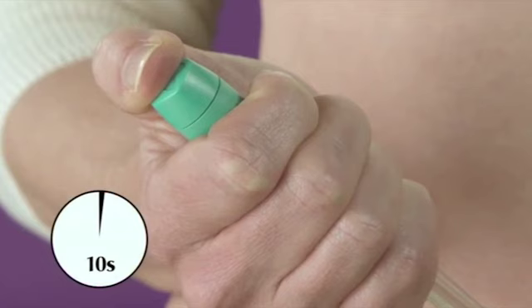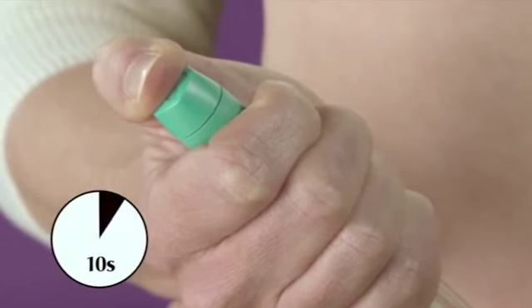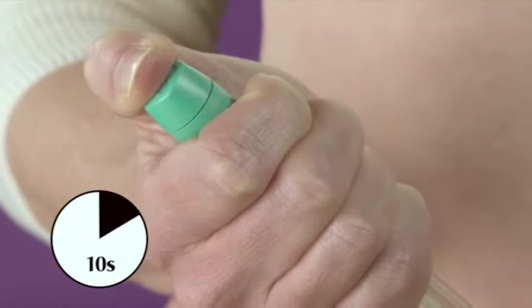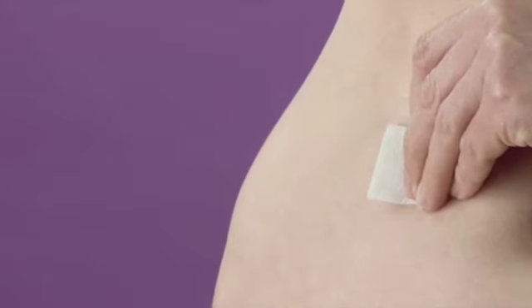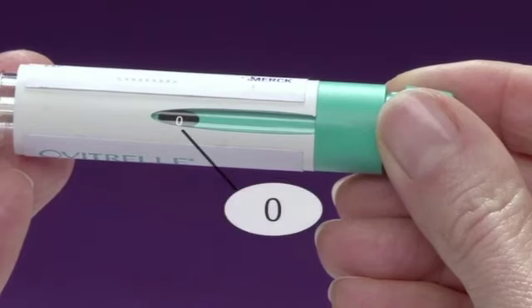With your finger still pressing the dose setting knob, keep the needle in the skin for 10 seconds. After 10 seconds, still keeping the dose setting knob pressed down, take the needle out of the skin. Apply pressure on the injection site. Make sure you have given yourself a complete injection. Check that the dose window shows 0. This will confirm that the dose has been delivered completely.